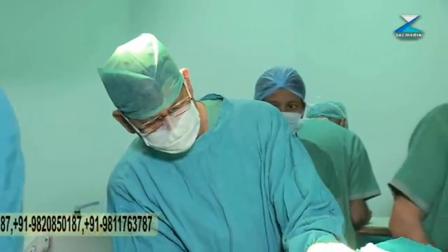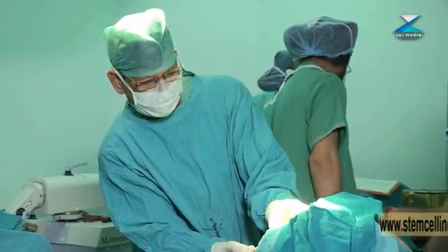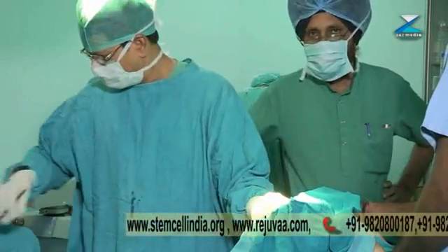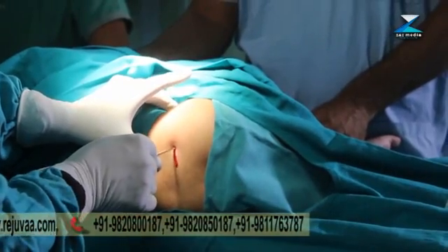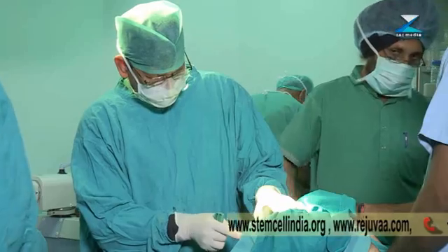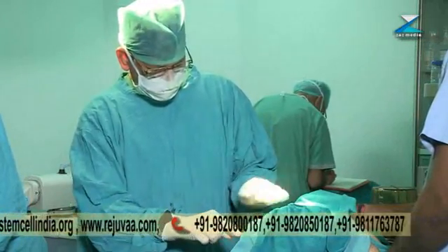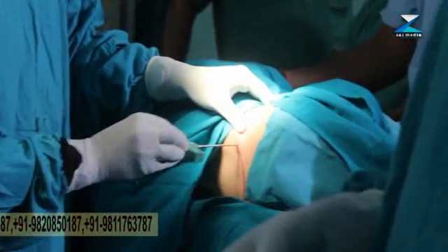Over the posterior ILAC crest, just beneath the posterior superior ILAC spine, we will make a small nick entry point with the number 11 blade. This is a Jamshidi needle — we are inserting it from the posterior side, resting it over the posterior ILAC crest, and slowly rotating and pushing it inferiorly and a bit medially. Now it is inside the bone, giving better purchase.